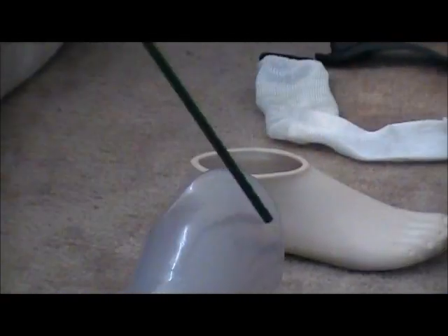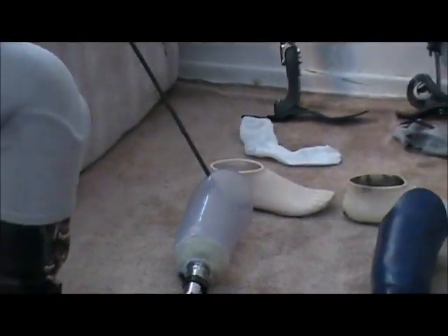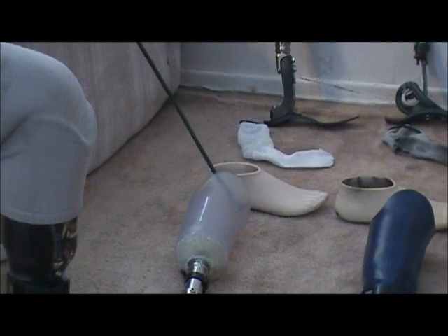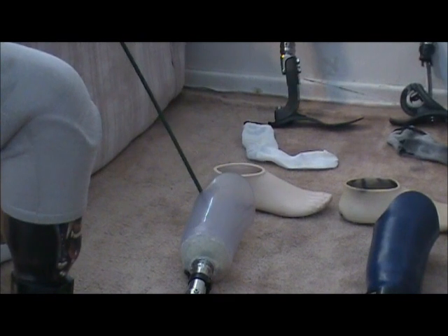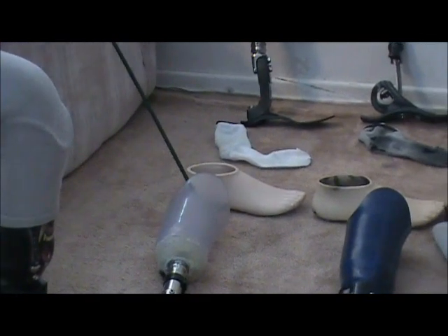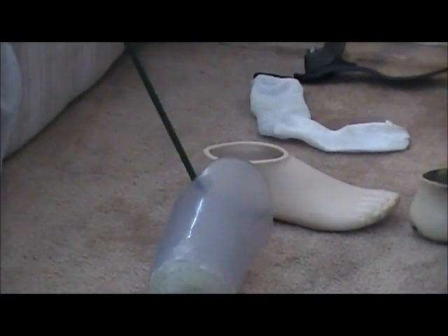This is a test socket before you get the finished socket. You can see through it, so that you can determine where you're making contact and how the fit is working. They can see exactly how it fits by looking at the residual limb inside the socket.